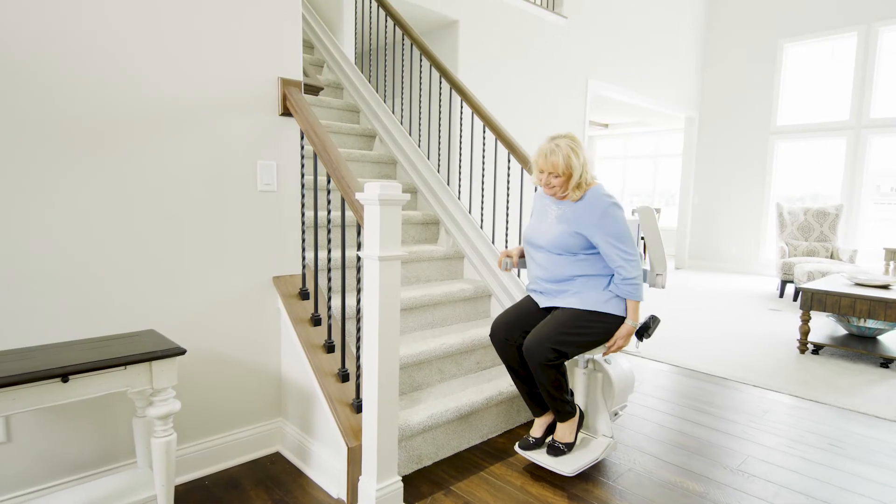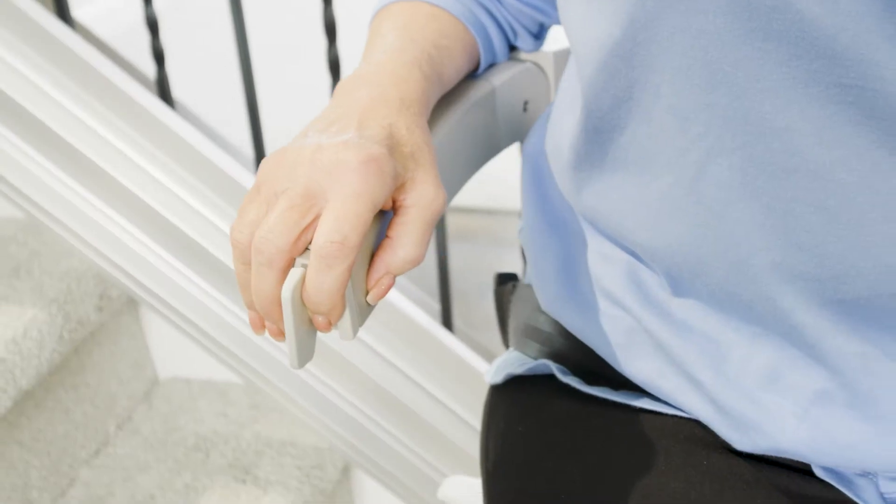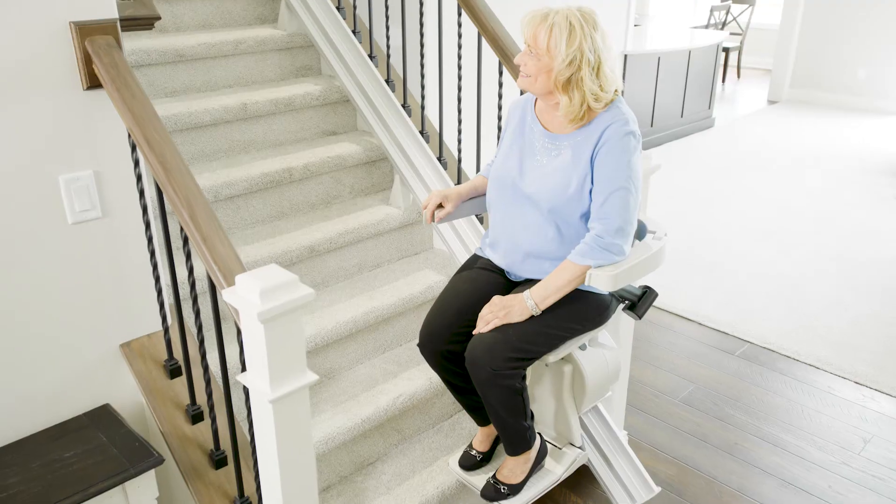The Bruno Elan is easy to use. Take a seat, clip the retractable seat belt, push the armrest control, and the Elan smoothly glides you up the stairs.